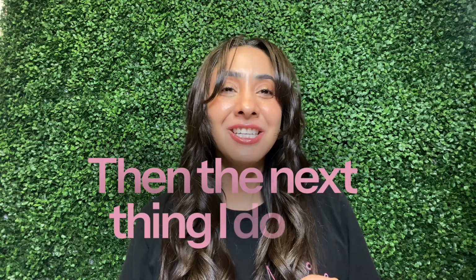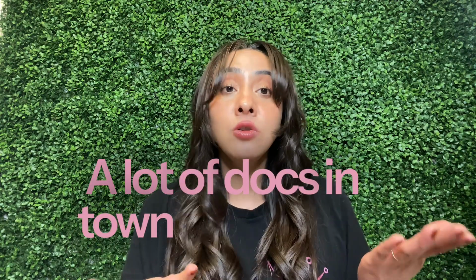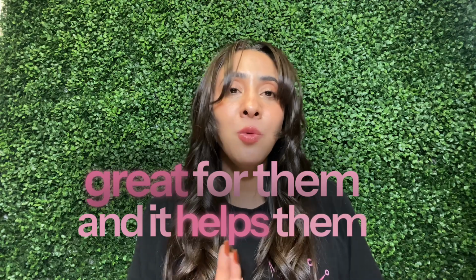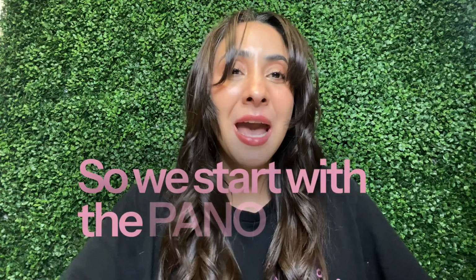Then the next thing I do is I generate a PANO. I share this PANO with my referrals. A lot of docs in town don't have PANOs just yet, and so this is great for them, and it helps them with insurance claims and just having that overview versus an FMX. So we start with the PANO next.